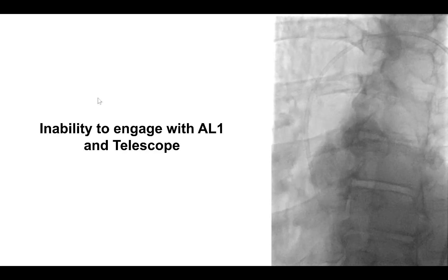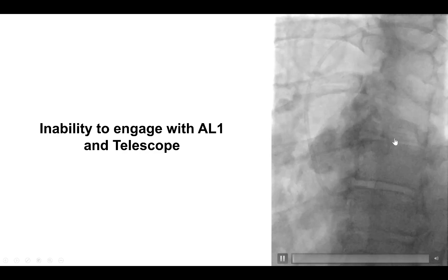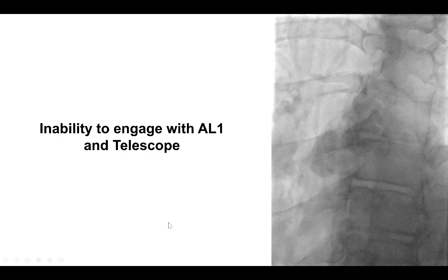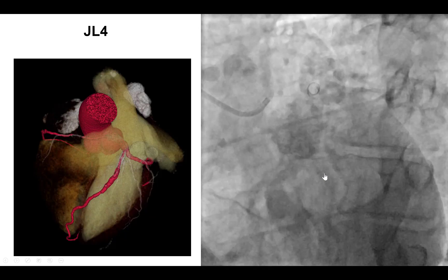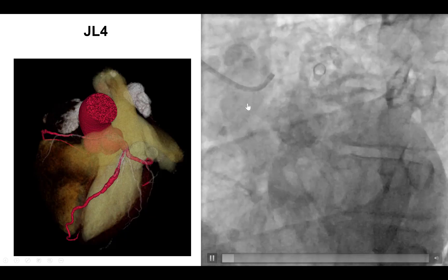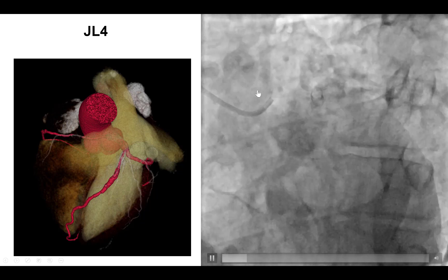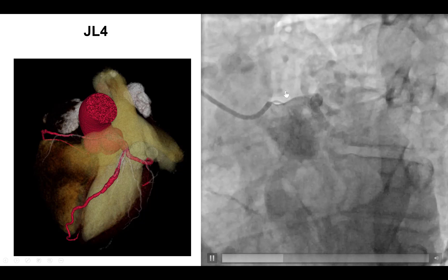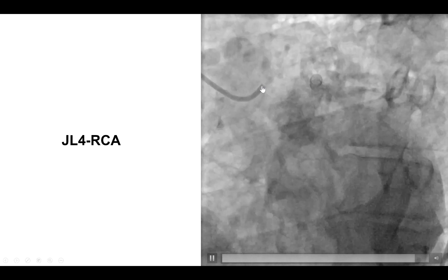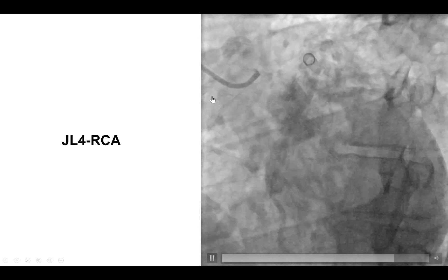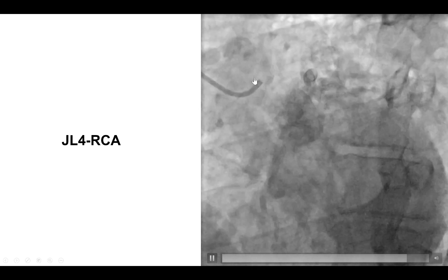The most important difficulty in this patient was to engage that anomalous coronary. We first tried with an AL1 guide catheter together with the guide extension, but unfortunately the guide extension kept entering into the left main and would not go into the anomalous right coronary artery. After trying several times, we changed to a JL4 guide catheter, which helped visualize for the first time the origin of the right coronary artery, literally very close to the takeoff of the left main. However, selective engagement was not feasible, and in cases like this, one way to perform PCI is to wire the vessel and use the wire as a rail to help with engagement of the guide catheter.